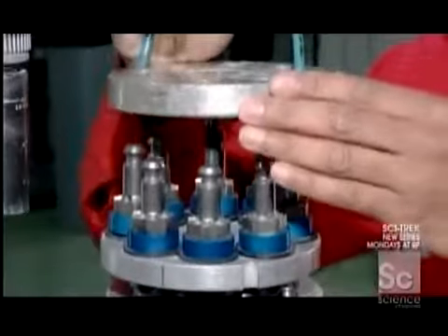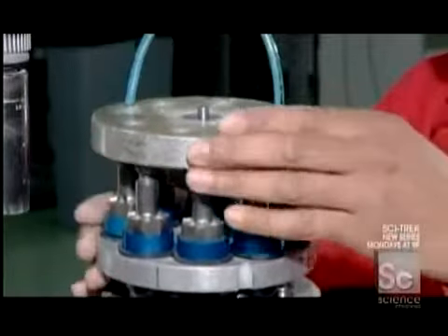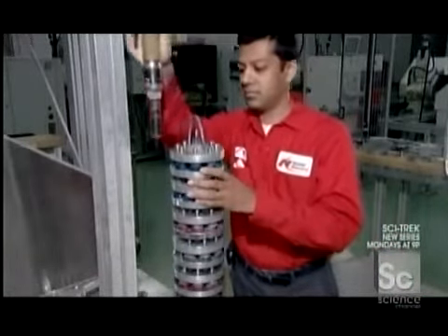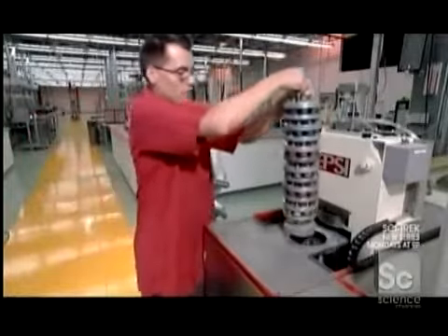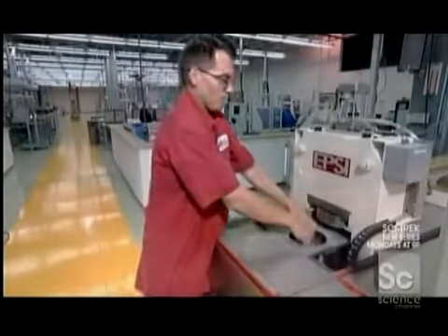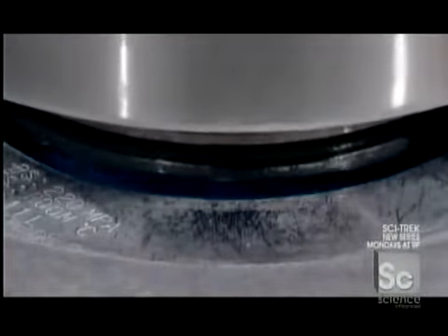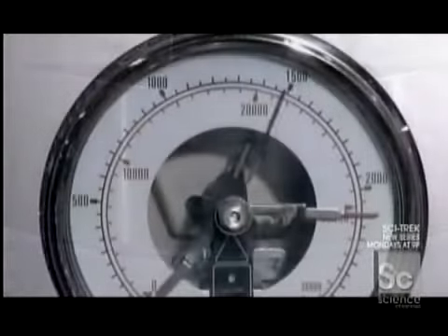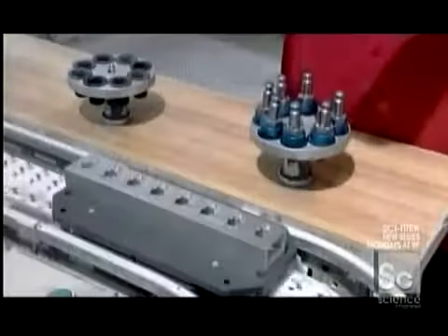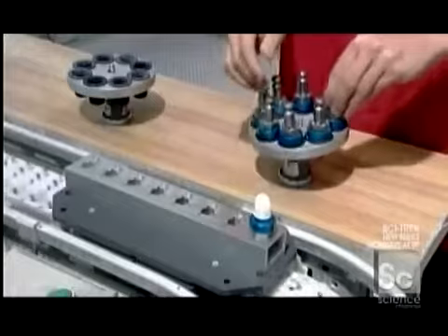A worker stacks several of the mold platters and threads them together with a metal rod. He transfers the rack of mold platters to the next worker, who plunges it into a water-filled chamber. He closes the lid and activates a pressurizing system. As the liquid pressurizes, it compresses the ceramic powder, solidifying it. This process takes just 10 minutes.